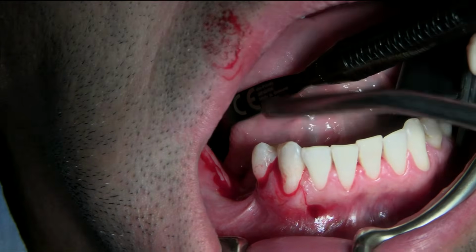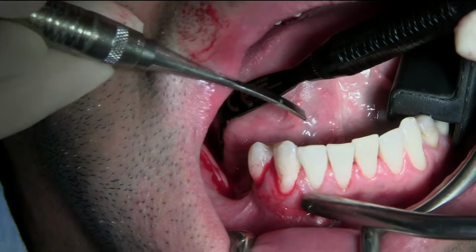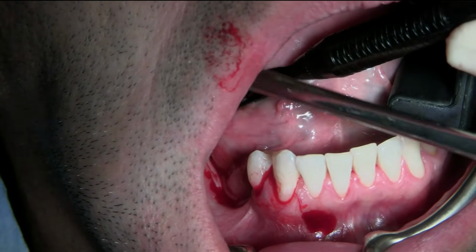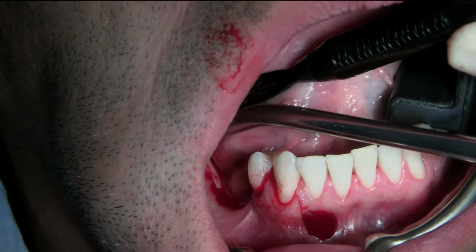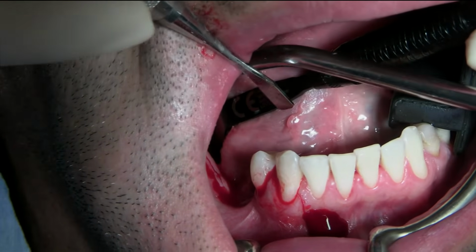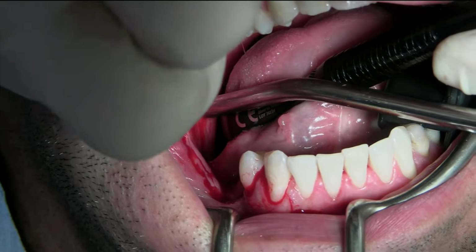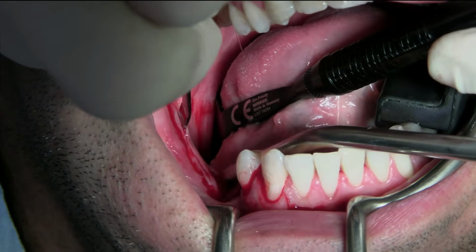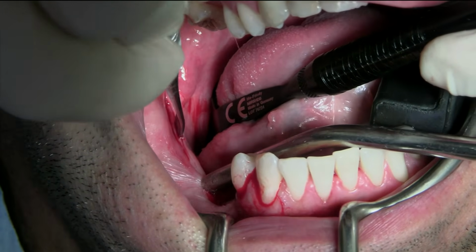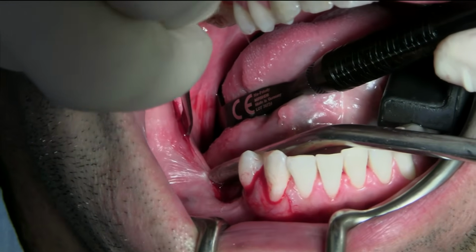Good. It's ready for the periosteal elevator. Now my next instrument, here's the elevator. Yeah. Here's the one. So that's my go-to after I make my incision from my U3D instrument kit. So I'm going down to bone, and I'm really trying to get through all the fibers. You can see the movement.